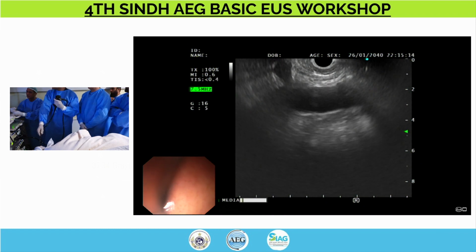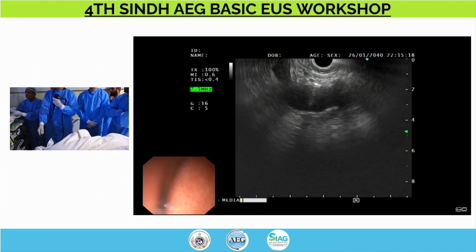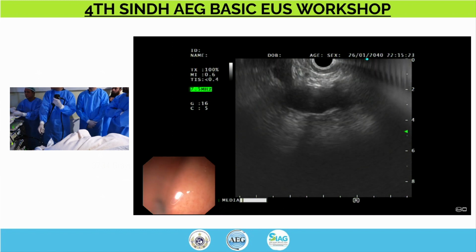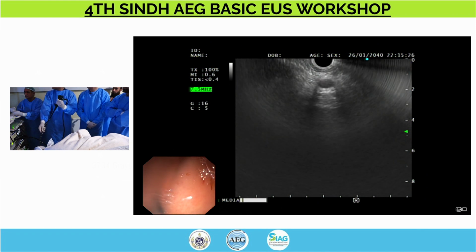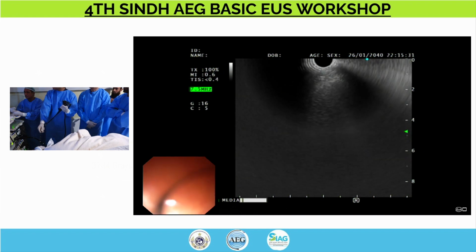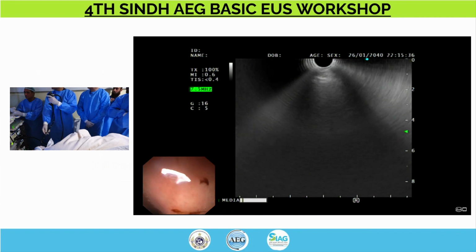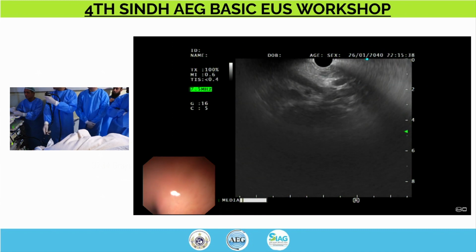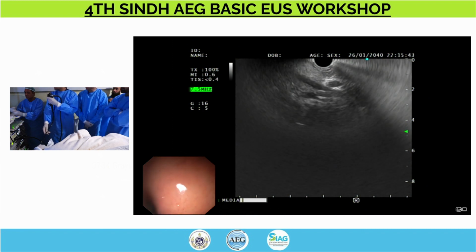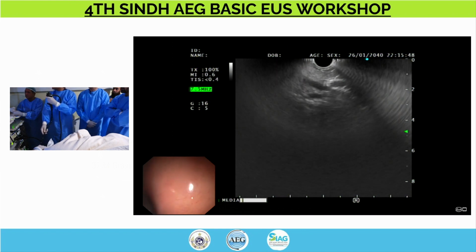Gaspai, can you hear me? Yes, I can hear you. So we have only one room available to do all the cases. And I think if we can finish it in 10 minutes, that would be great. Even though it's an excellent demonstration, we would hate for it to finish. In that scenario, I shall teach Afan each station, and once he's good with that, he's satisfied with that, we'll go to the lesion straight. Is that okay? Yes. Okay, fine.